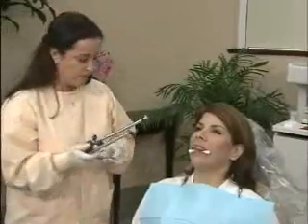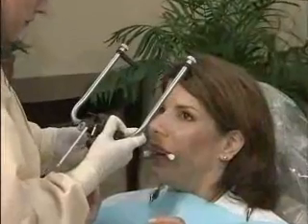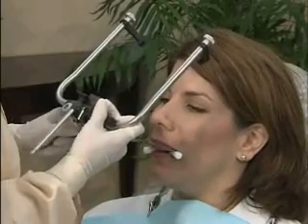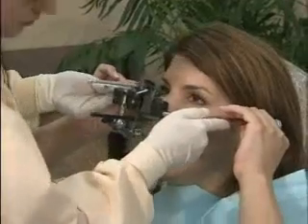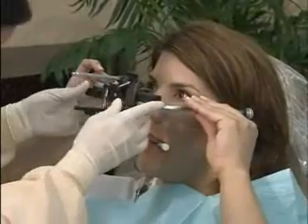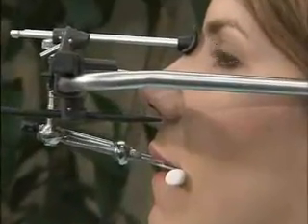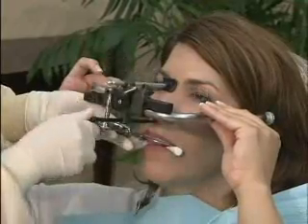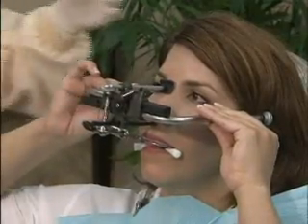Next, slide the fork arm through the hole in the joint piece and move the ear pieces near the ears. Allow the patient to insert the ear pieces in the ears and lock the clamping lever. Slide the subnasal pointer towards the patient until it contacts at the subnasal point. Stabilize the face bow by contacting the nasal support with the nose and locking the fixing lever, or have the patient hold the face bow.